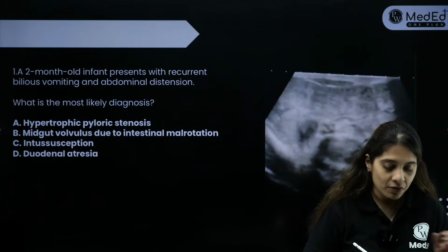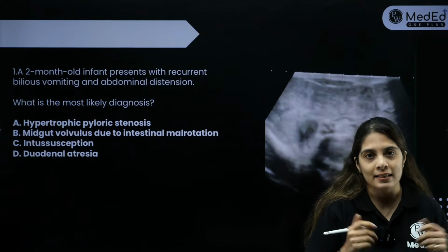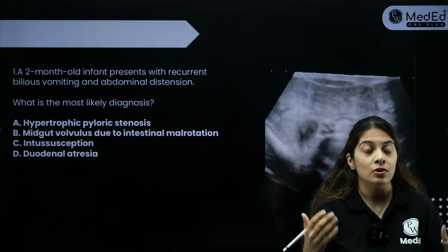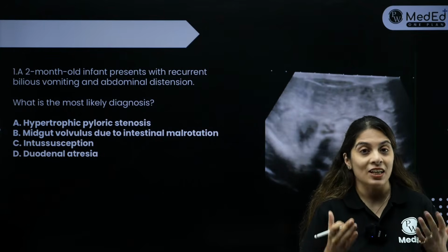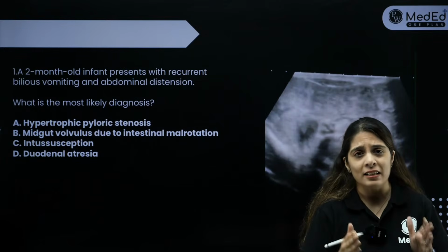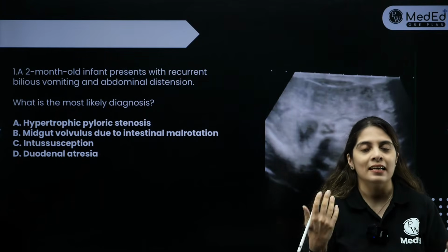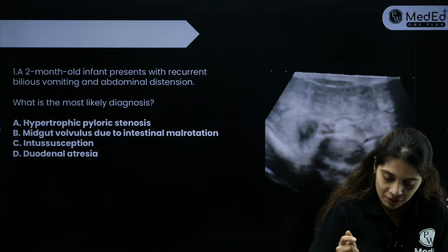Chalo, let's start with our first question. We'll read the question, then I will show you the video, and then we will discuss the answer. That is how we are going to approach. We are going to discuss 10 to 12 questions in this particular class, and of course, we will also be uploading more and more videos on the app. These are some of the collection of videos which I had, and we are going to discuss. Again, they are important. You have already seen all these videos in the form of images. Nothing is new. Nothing is something which you have to learn again. It's just that the presentation of the question will be a little different. Okay. So let's start with our first question.